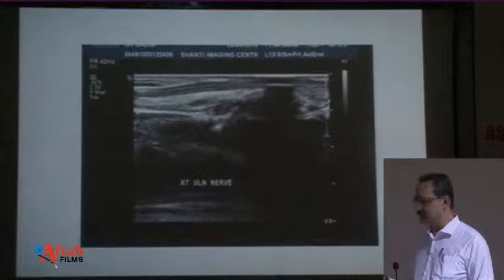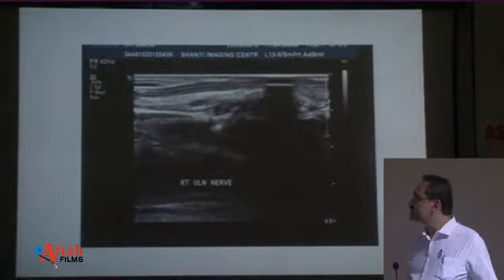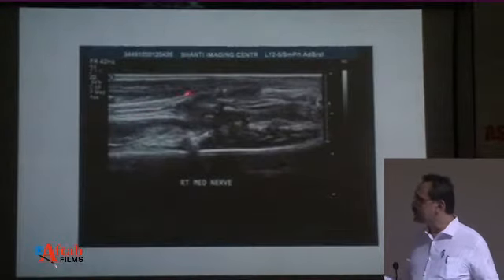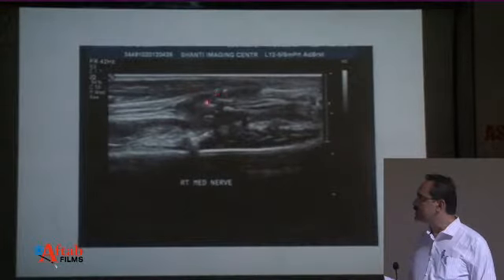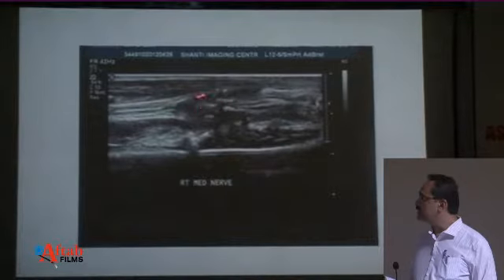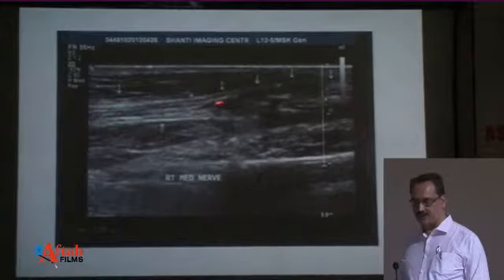In this case you are seeing it. And this is a severe case in which you are seeing a discontinuation of the nerve fibers. This is avulsion injury, crushing injury, there is discontinuation. This much length is discontinued. So you can measure the distance, and this will help the surgeon to decide about the management.